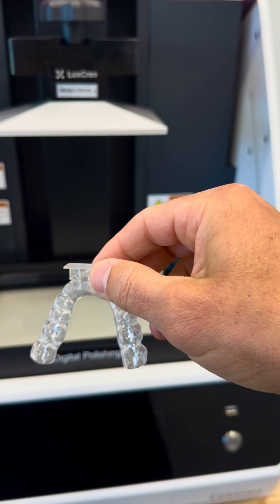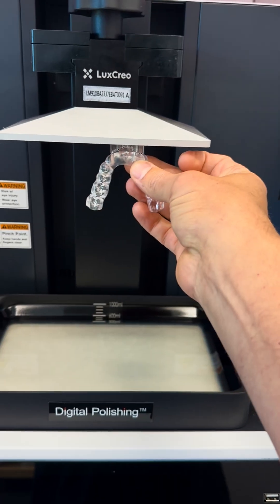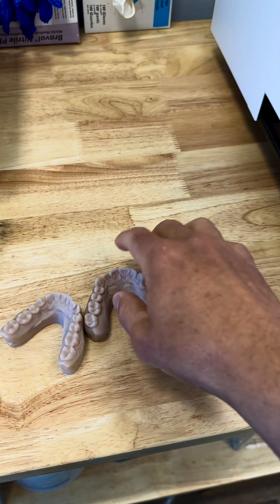And then you get something that looks like this. You can still see the little support structures right here where that would attach to the platform. Once that comes out, we take and clean these up, do any fine tuning we need, and we can do multiple different things.